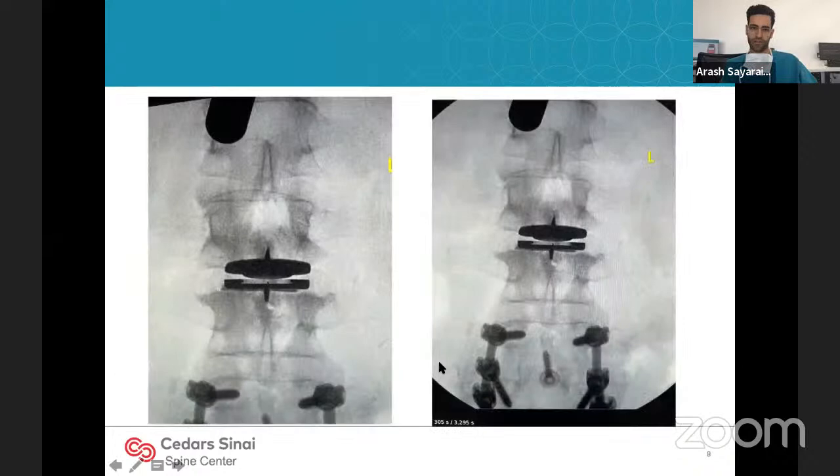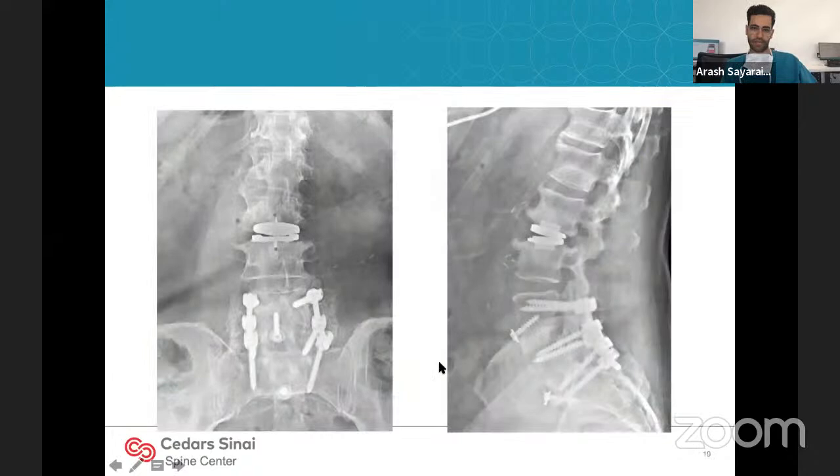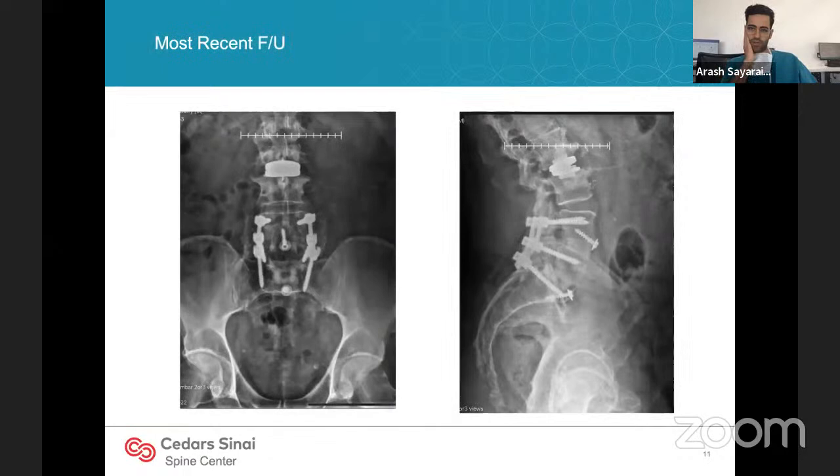These are his initial post-op x-rays. And these are his final, most recent follow-up x-rays. He's been doing well. Looks like the L3-4 level has been holding up. I'll leave it there. Interestingly, I tried to do some literature review on skip level or non-contiguous level arthroplasty. I couldn't find anything in the lumbar spine. There's a good amount of literature in the cervical spine looking at non-contiguous adjacent segment degeneration, and how that's treated from a biomechanical standpoint, looking at fusion versus arthroplasty. But I think this is an area that would be of interest to look at further, to get a better sense of how you manage these and how they do long-term.